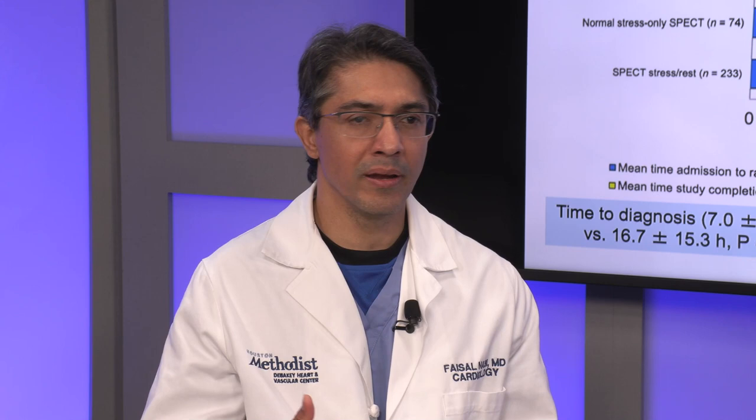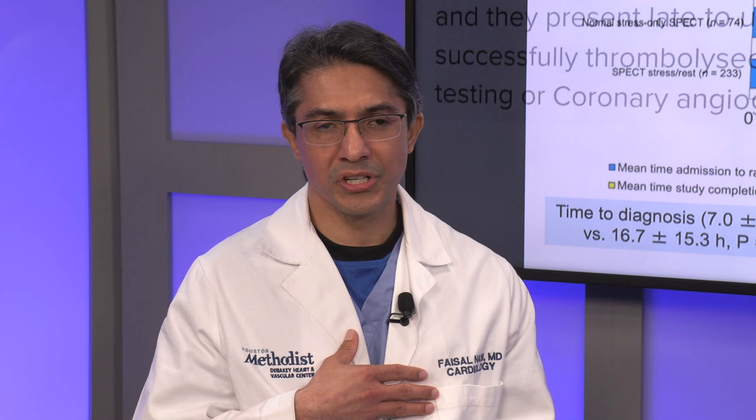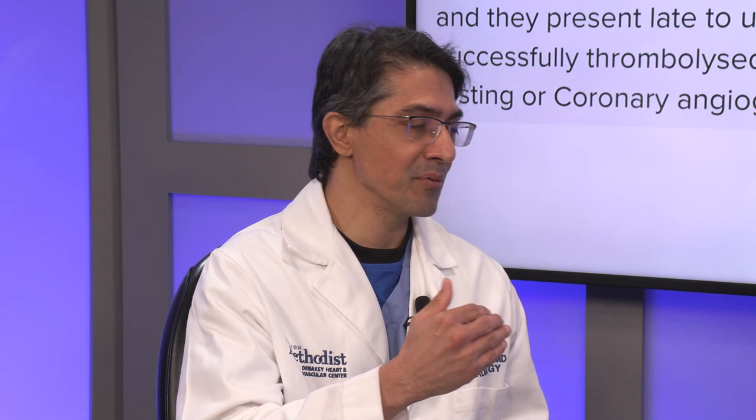Yeah. So for our surgeons, we can definitely image all the grafts that they are interested in imaging. So we can see both the IMAs, we can assess their patency, their quality, their size. We can look at the different grafts. We can make sure where they are in reference to the sternum and really give surgeon advice as to where grafts are. And I should mention also even the RV, because we know that oftentimes we see the RV stuck to the sternum. So I think those are situations where we use it.